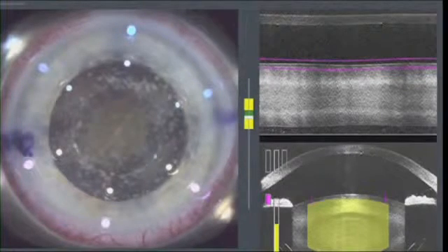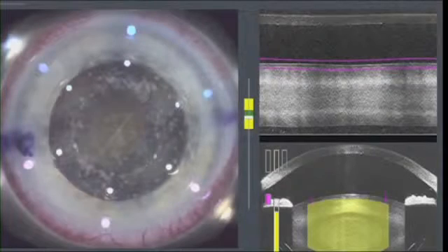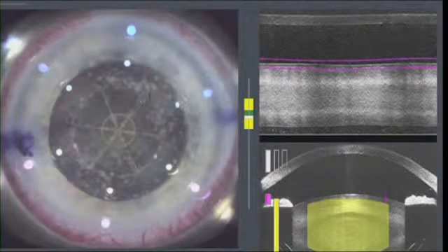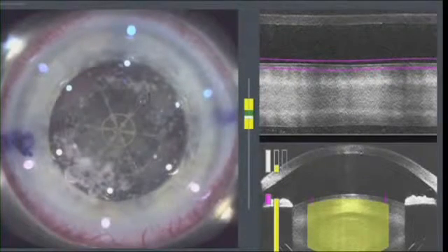Then, the cataract is softened using six wedges and a central cylinder. Now, the incisions are being fashioned in their precise location.